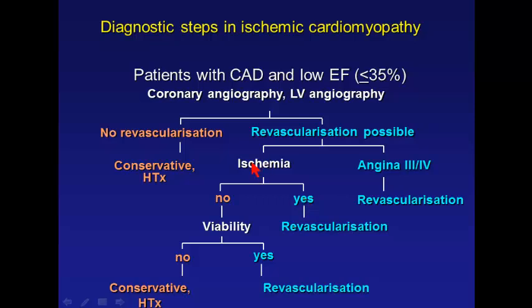If, however, we cannot detect any ischemia, because, for instance, we use SPECT instead of PET, and we have these problems that we just saw, we have no increase in flow, or we have microcirculatory dysfunction, which also prevents us from having a flow increase and for an induction of heterogeneous perfusion pattern, then we go for testing of viability.